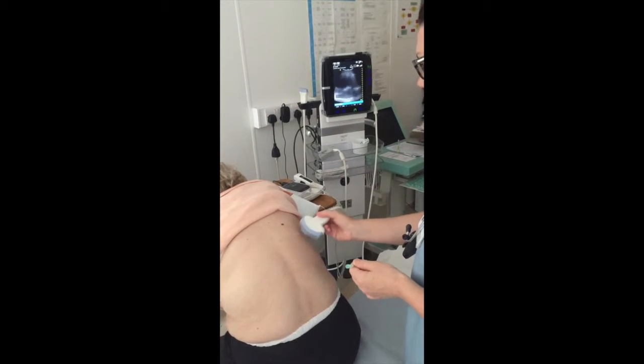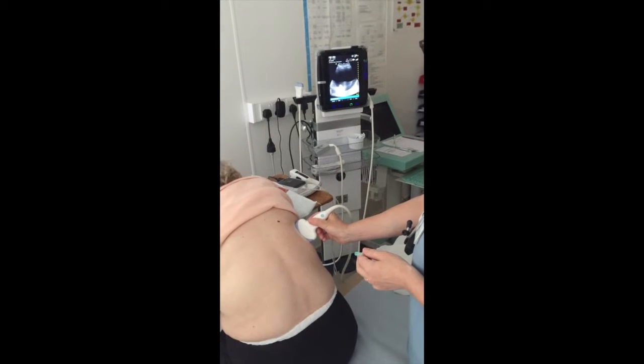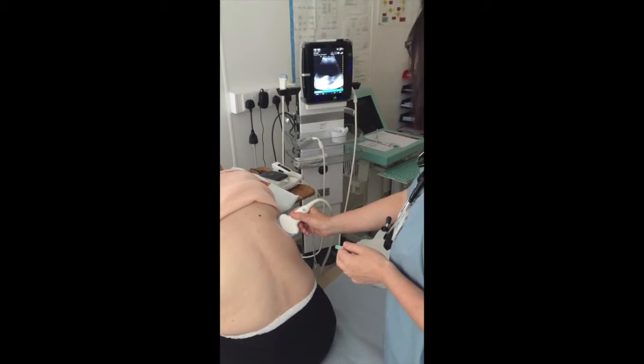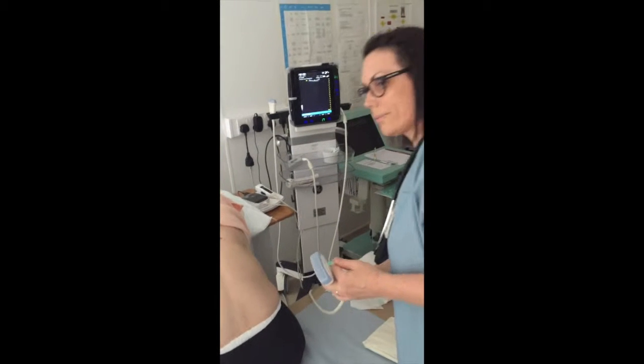Then again we'll scan over the top just to make sure that we're happy with that position. We can see a large fluid collection there. We're away from the diaphragm and any other internal organs, and there's about a 2 to 3 centimetre depth to get into that collection, so I'm happy with that marking. Okay, thank you.